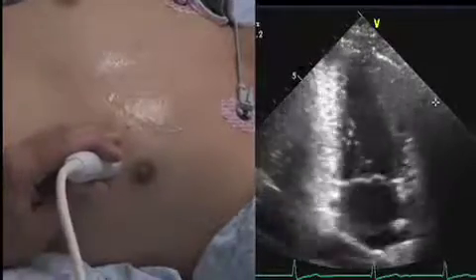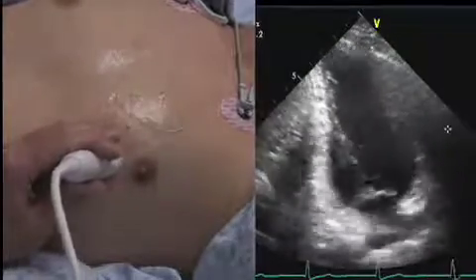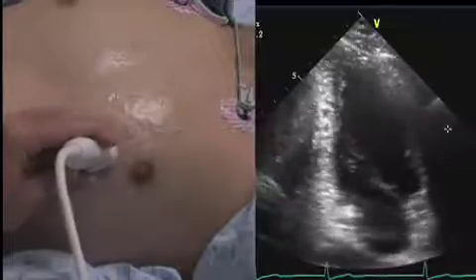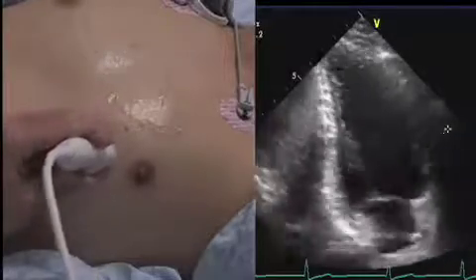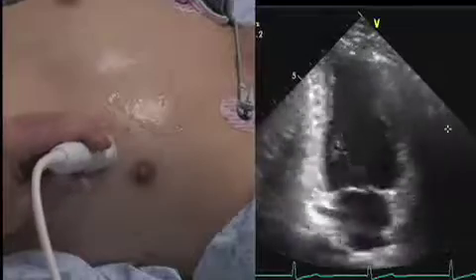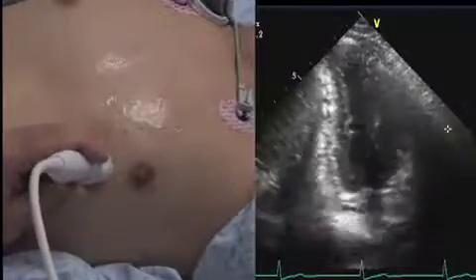Look at my hand. If you notice, the heart is pointing off to the side. If I adjust my transducer parallel to the beam — or the wedge — coming out of my probe, you can see how that affects the transducer moving across the screen. So in this case, I'm going to need to move down the tail of the transducer a little bit to make my ventricle more vertical on the screen.